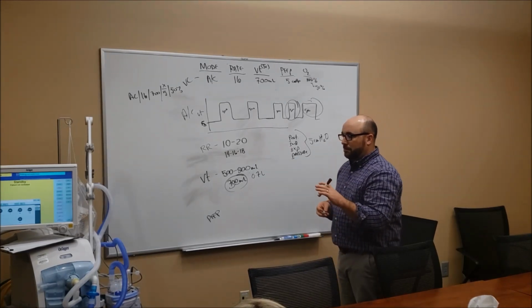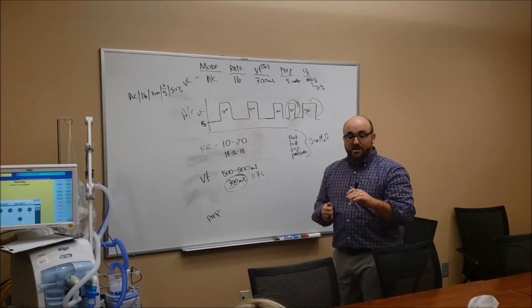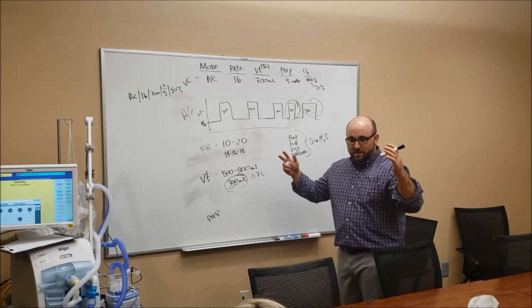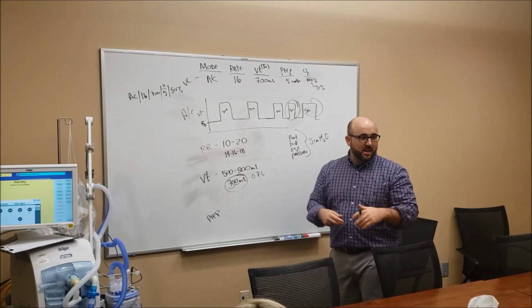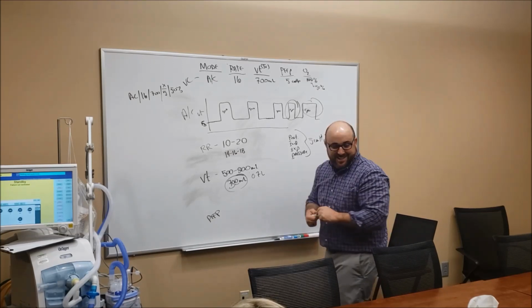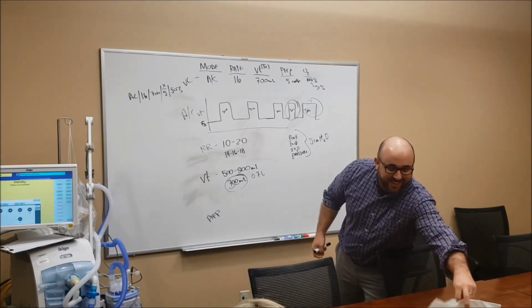They do put people with LMAs on ventilators in surgery, but that's a totally different situation. Sedated, paralyzed, you're just a big chunk of meat right there and they can do whatever they want with you. So that's the way I kind of think of it. Your patients are not going to be like that. All right, cool.